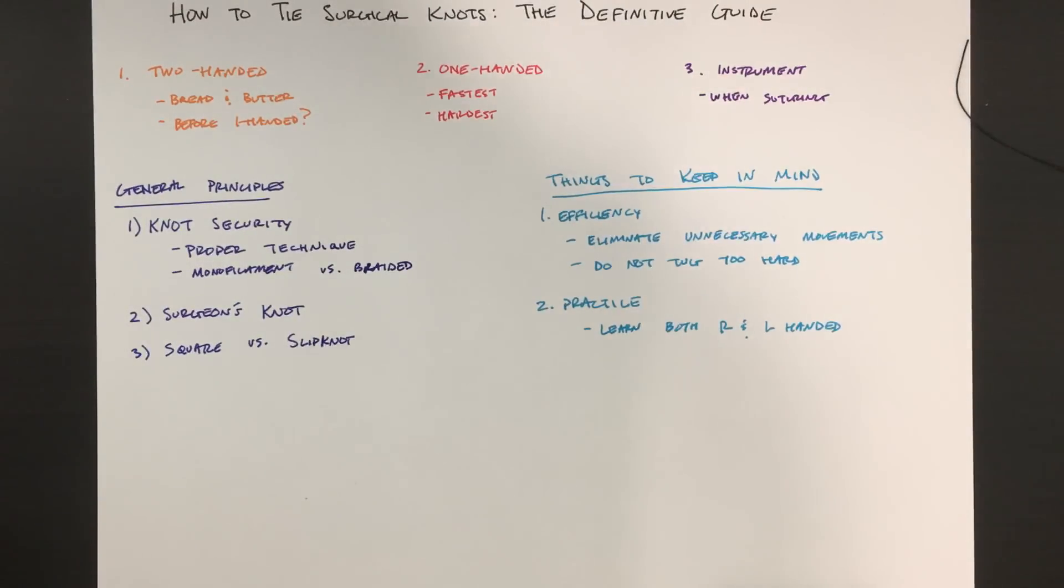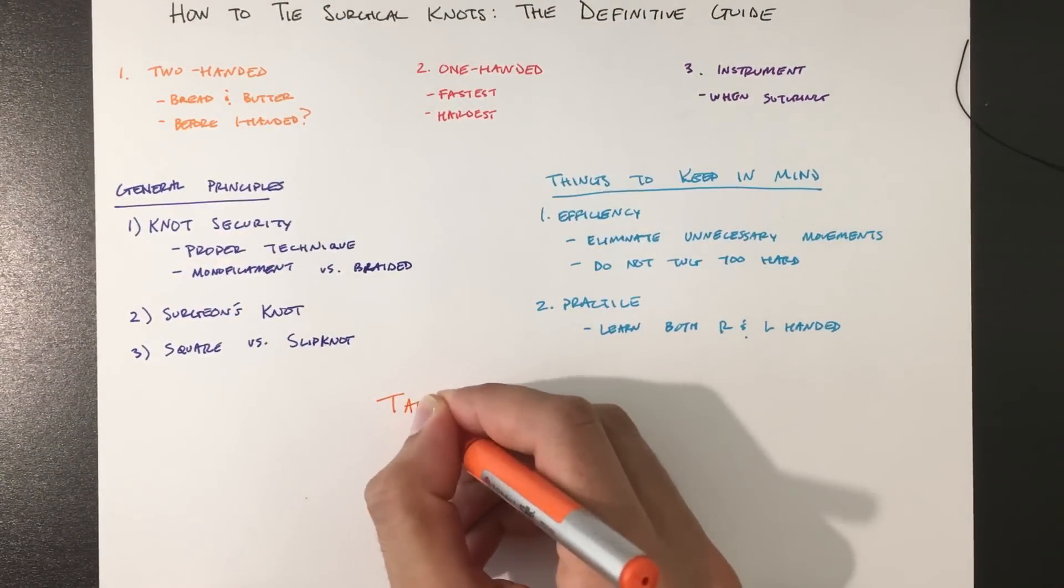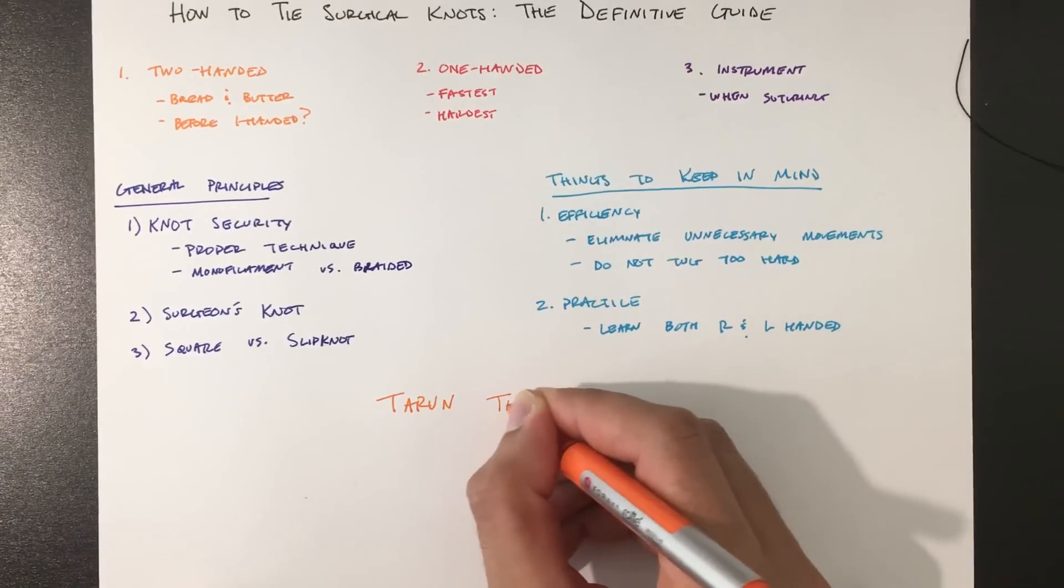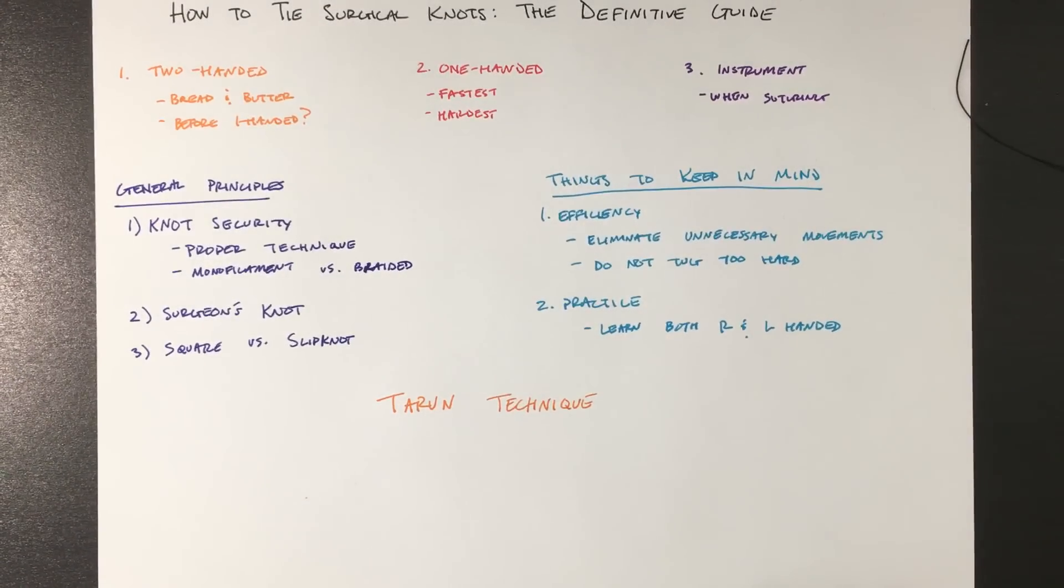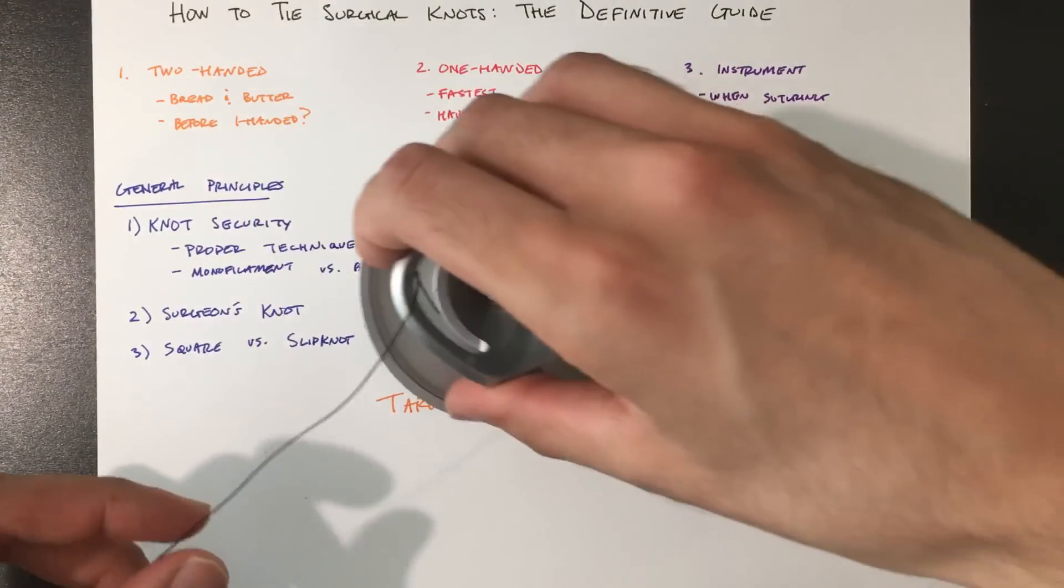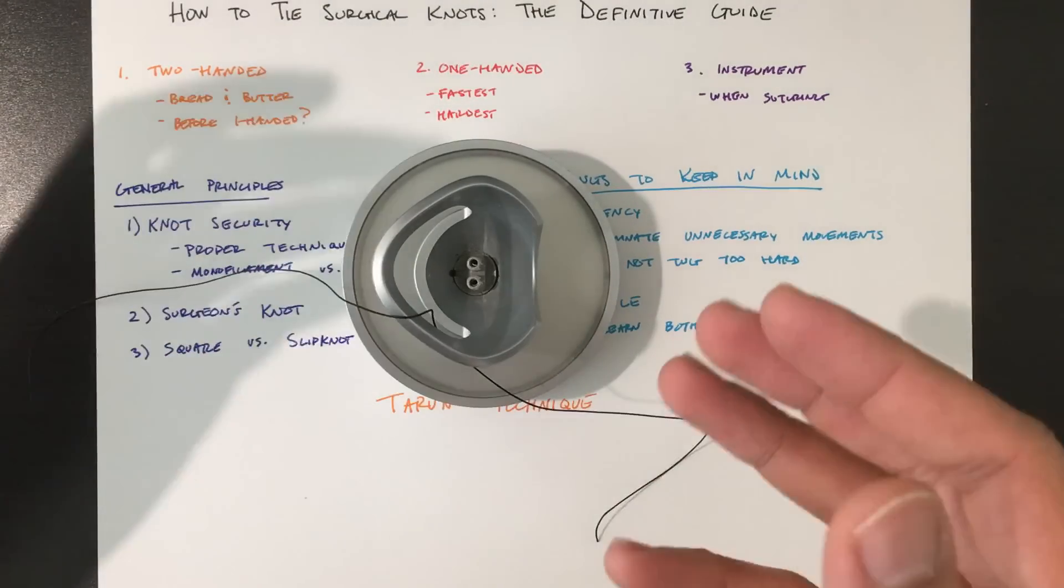Alright guys, so the last technique I'm going to show you is this cool trick. It's called the Tarun technique based on the person who taught this to me. So this will show you how to tie a surgeon's knot using a one-handed tie and you'll do it in one movement.